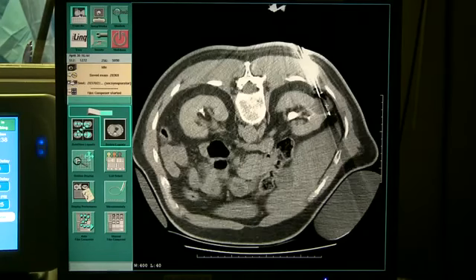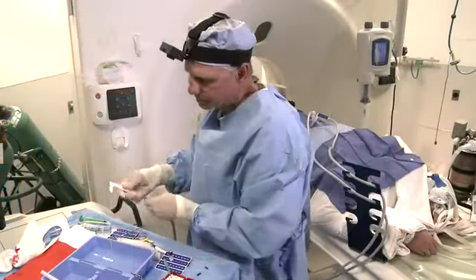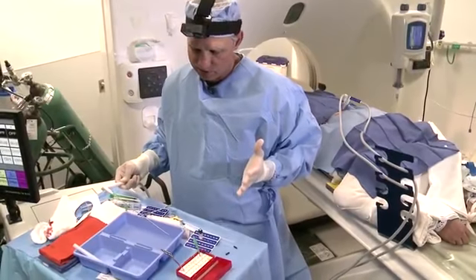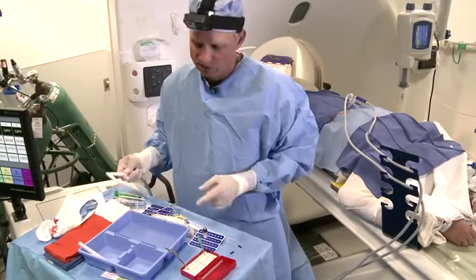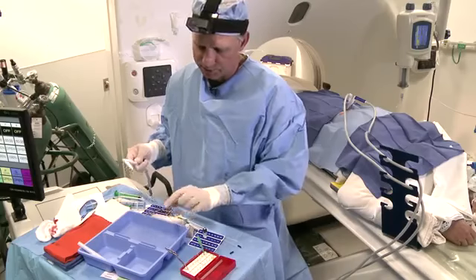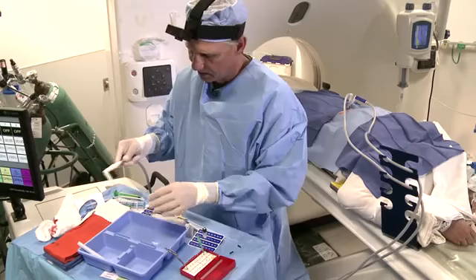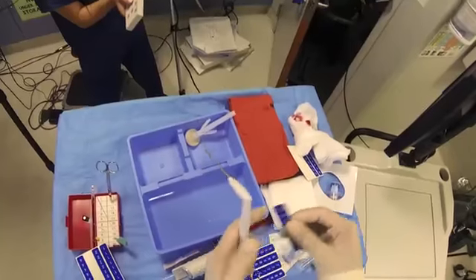It's expensive. So if you're thinking extra probe, do it. So this is our 3rd probe. One phenomenon that happens as you put probes in, one gets in the way of the other. So one of the reasons to use a long probe is so that the handle will stand above the others and it won't be in your way. This is in the 3rd slot over there, so with these stickers I'll mark it number 3.